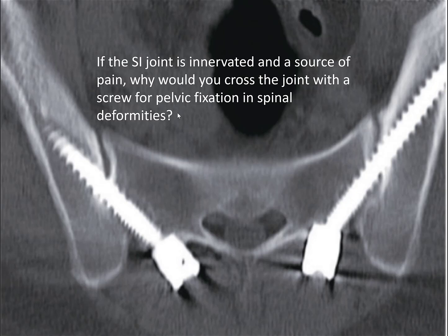No, but I have discussed this with Kabesh, who does a lot of these. I said, what do you do? If your fusion is solid, would you just go in and take out the screw? And that's what he would do. But then I said, don't you increase the chance of a sacral insufficiency fracture now that you've taken that out? He said he hasn't seen that. I have not either. The patients have done well enough that I haven't had to do anything. But that's what I would consider doing, just taking out that one screw after the construct is solidified and it's accomplished its goal.